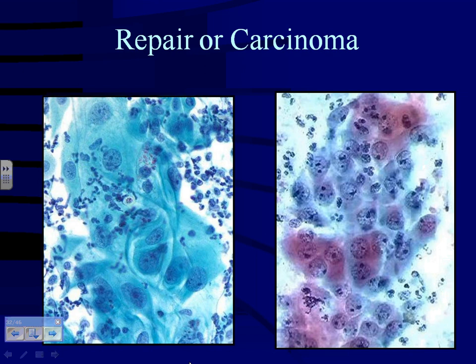Carcinoma. Okay, raise your hand if you think the left is repair. Don't be shy. All right, so half of you, okay. So that means the rest of you think that one's the cancer, right? Okay. Well, that's wrong if you thought it was cancer, okay? Because actually the left one is repair, the right one is cancer.